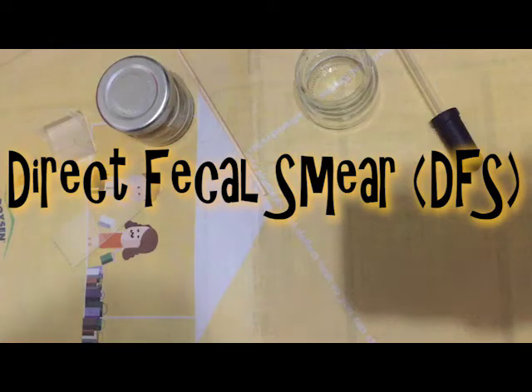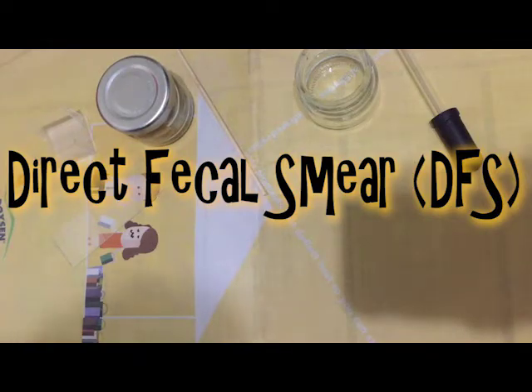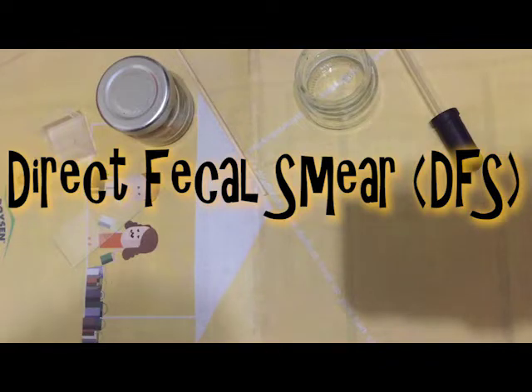This is considered to be the simplest technique in stool examination. A good preparation uses approximately 2 milligrams of stool.